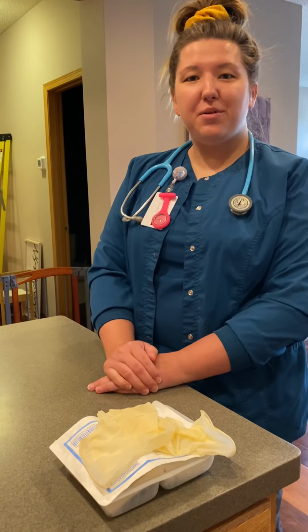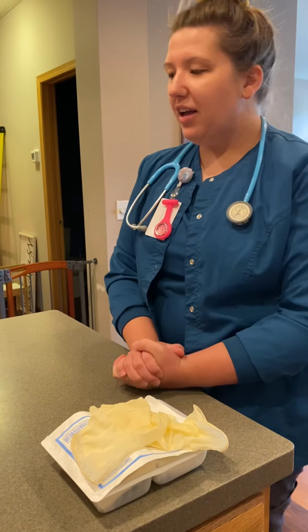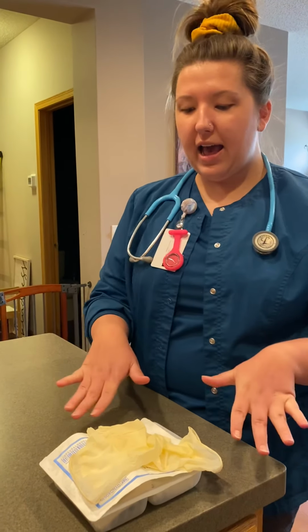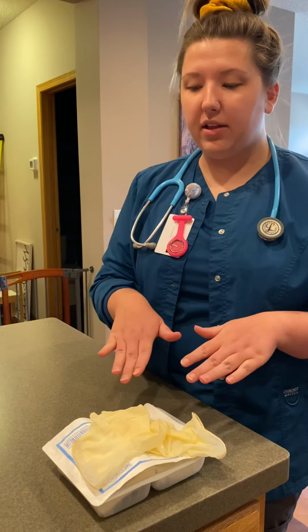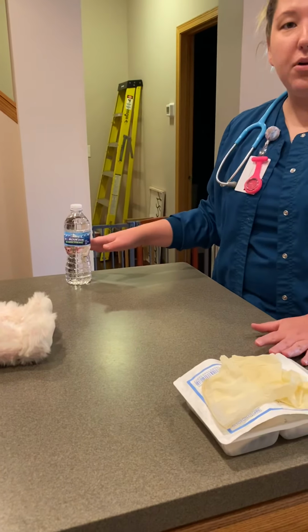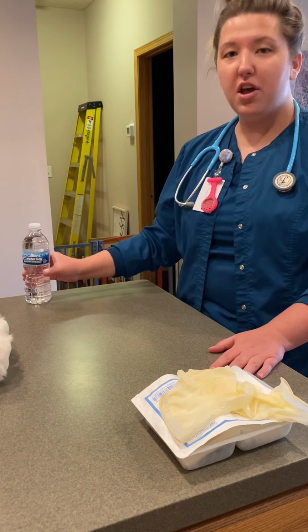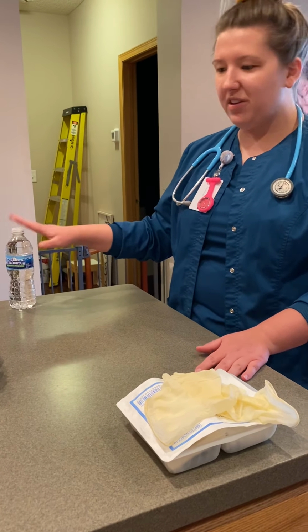I'm Abby. I'm going to be doing my Trach Care skill. So I'm going to ensure that I have all my supplies before we get started. I have my sterile kit here. I have my clean gloves. I have my peroxide and my saline, but I don't have either today, so I'm just going to use this, which they are both unopened, so I'm just going to leave that there.